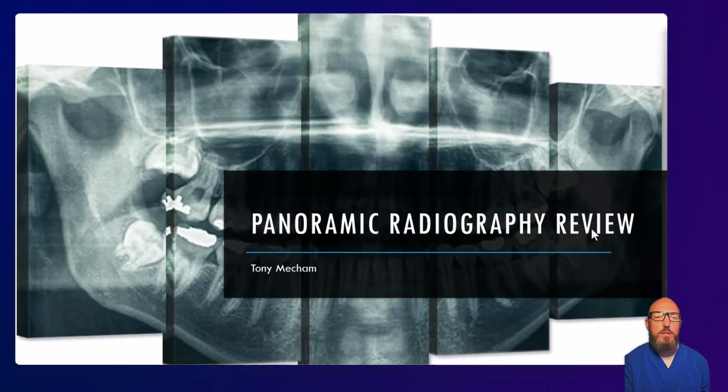The Canvas quiz you'll also see is going to check on how well you're doing with this. If you do want to go back and review my previous videos, I have a more detailed panoramic video as well. What I want to do here is focus on what matters most for this course, recognizing panoramic anatomy, and recognizing one important artifact, the ghost artifact. So really going to focus on those two things.